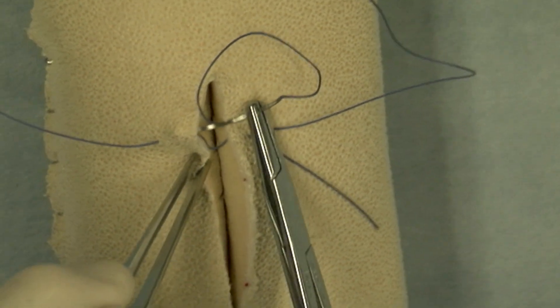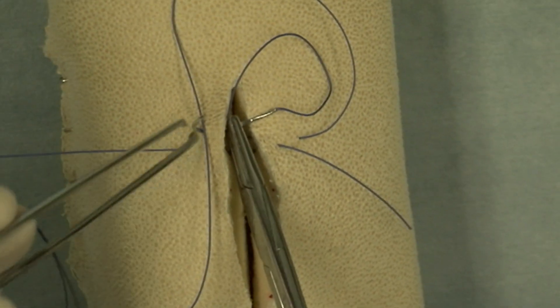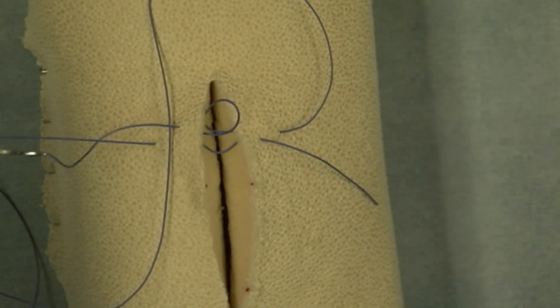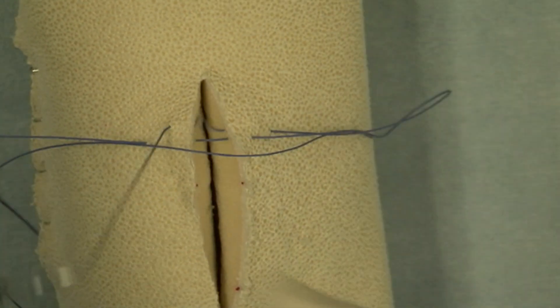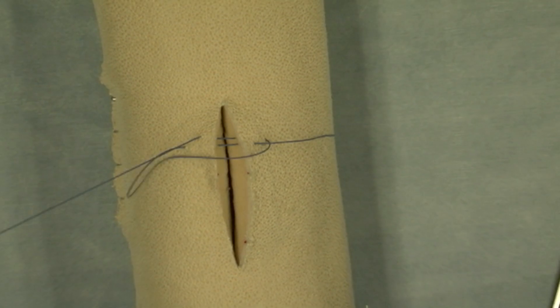Now I've taken care of this time to make sure that both arms of my suture are on the same side so I don't cross the suture. Although it's probably not that much of a worry.